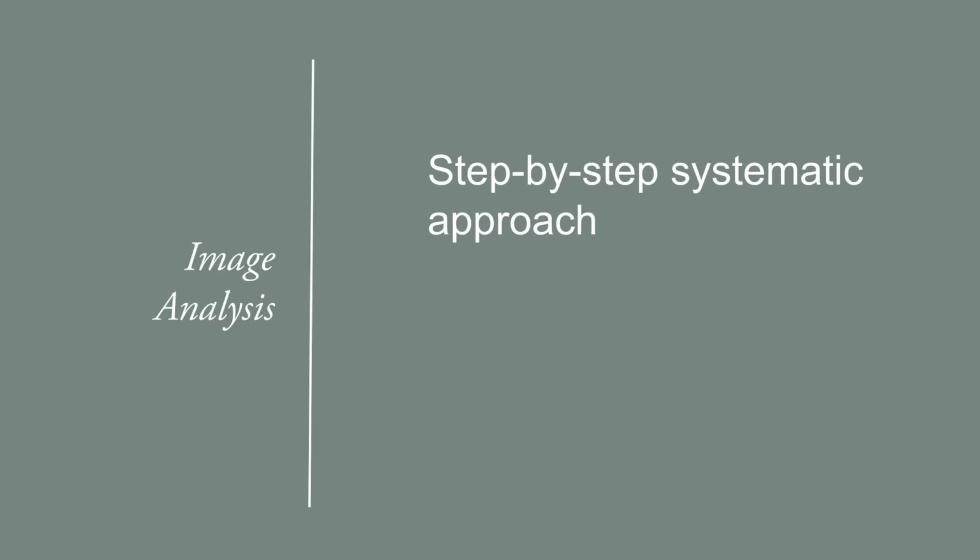Enough of that. Coming back to radiology, similar to what we did with the casino picture, a step-by-step systematic approach will provide us with the best diagnostic information. The information is there and we have to harvest it.